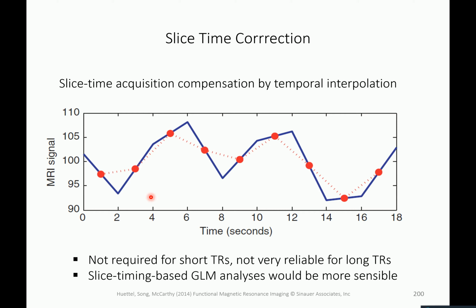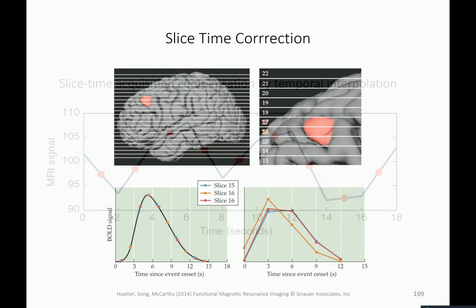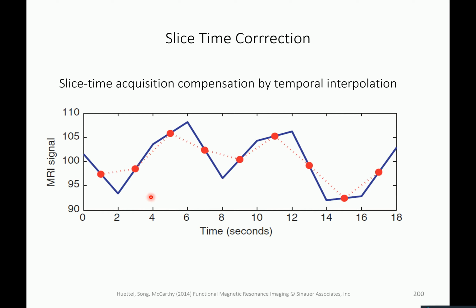Yeah, but the problem is kind of understandable. You can do interpolation against it, but then interpolation will maybe not really work. Of course, I'm also not explaining in detail here how this interpolation really works, because I would have to talk about interpolation. So yeah, you can do slice time correction. You cannot do it. Better would be to do slice-specific data analysis. Please develop that.